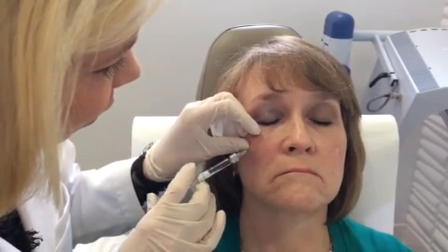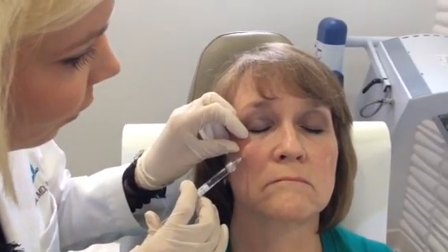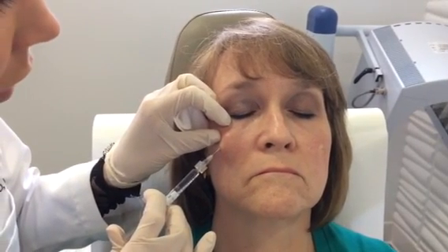I'm actually all the way right on top of bone, just at what we call the medial canthus of that area of her tear trough, just that very top apex of that. And I just slowly withdraw, and we're going to fill up that area with a little bit of Restylane.